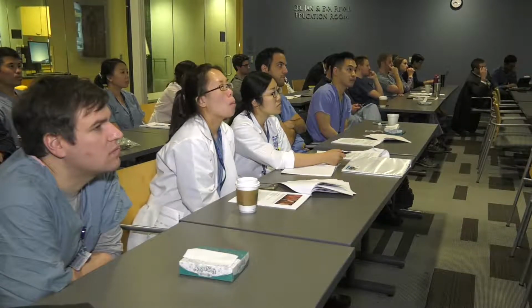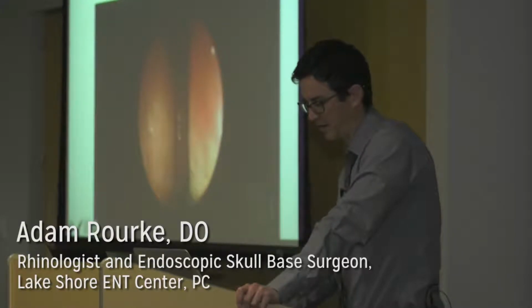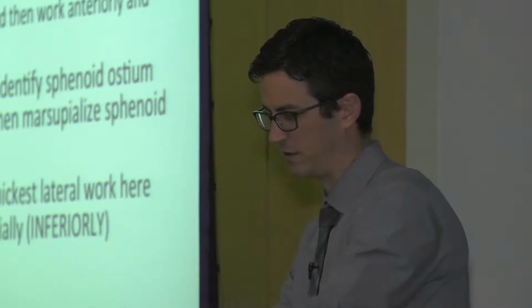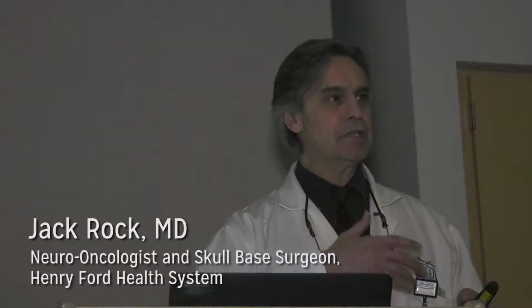All right, so we'll start off with the maxillary sinus. Medializing the middle turbinate here. This is a right nasal cavity, the uncinate here, and then this is actually just moving deeper in. That's actually the bulla there, uncinate here, covering up most likely the natural ostium. Once again in that next section of cells, as well as the skull base superiorly. This is a point in time where you're going to start to identify the natural ostium perhaps. For this intracranial, intranasal anatomy.